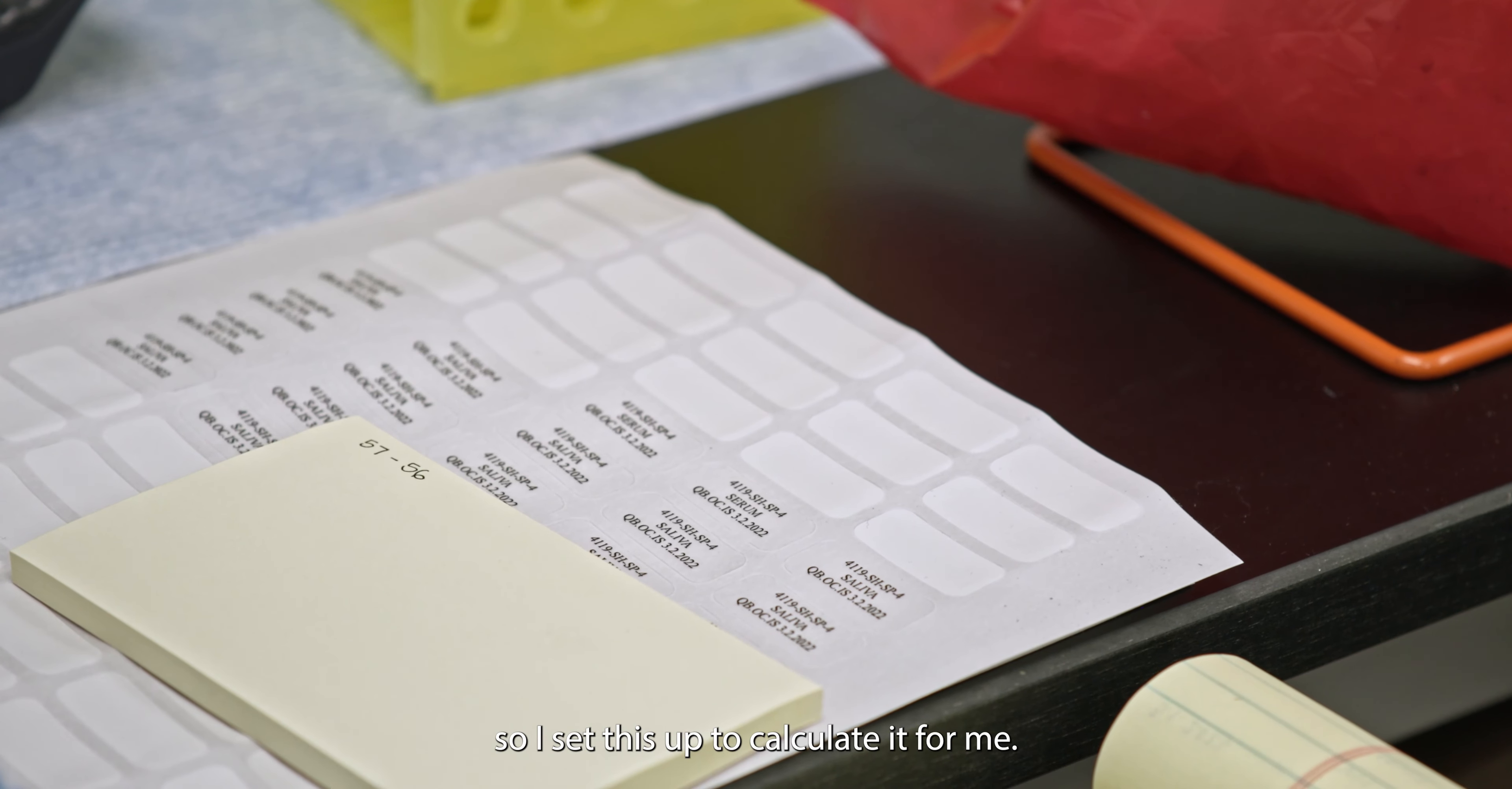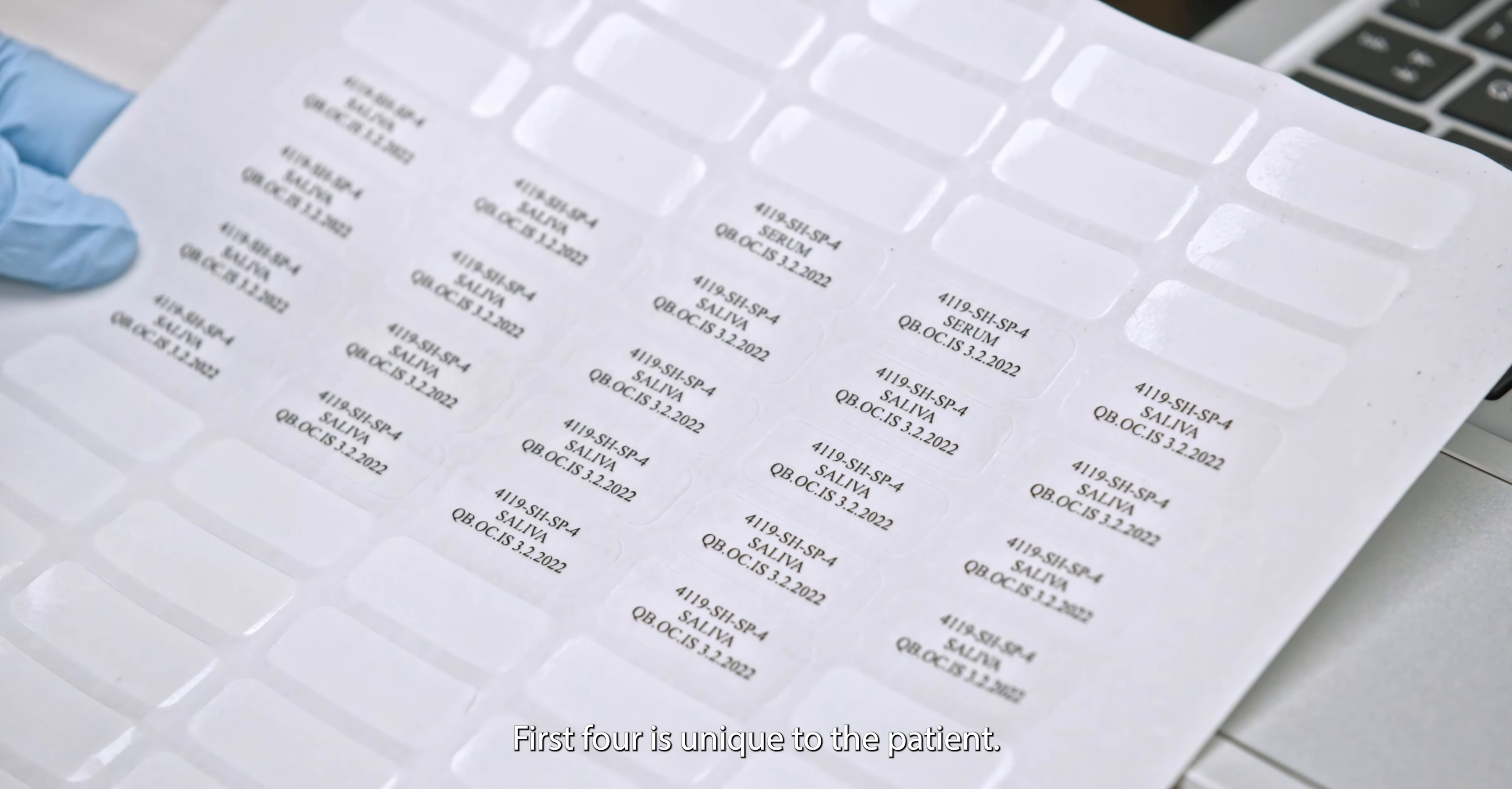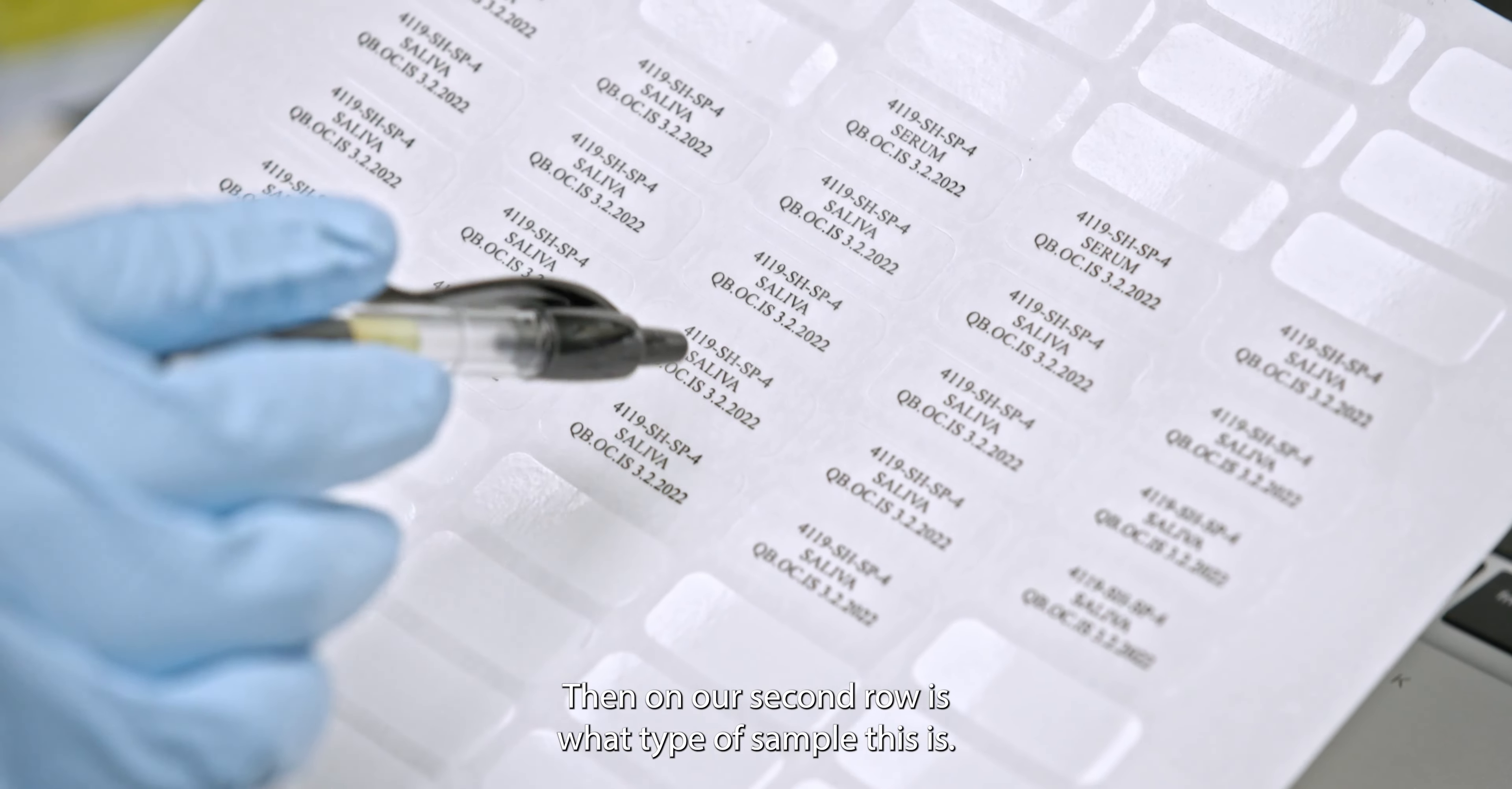So I've set this up to calculate it for me. This is our cell total, how many vials we need to freeze in, and the density it'll be frozen at. So we've got our sample IDs. The first four is unique to the patient. The letter code is going to be indicating what study they're in. This one is called Spitfire. And then the last number is how many times they've come in to visit.